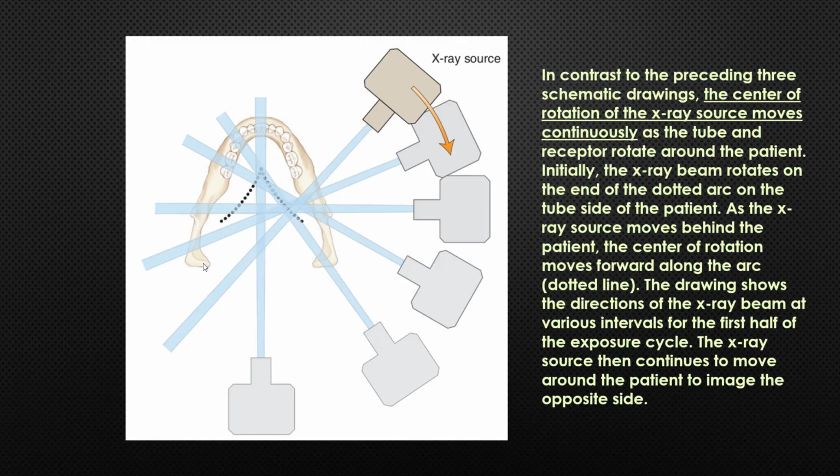And that means the image starts with the patient's left side. If done correctly, it should start behind the condyle. The first thing you image is that left mandibular condyle, and then the left mandibular body, the teeth as well.